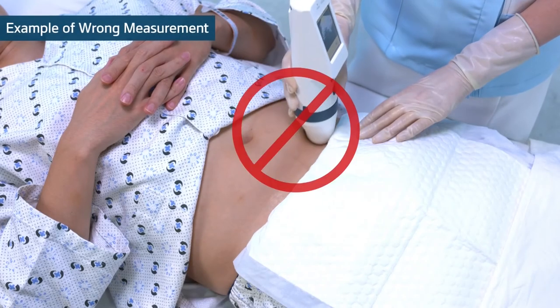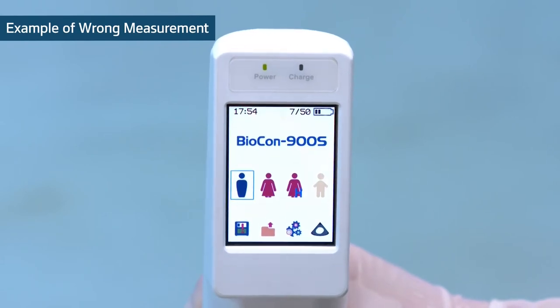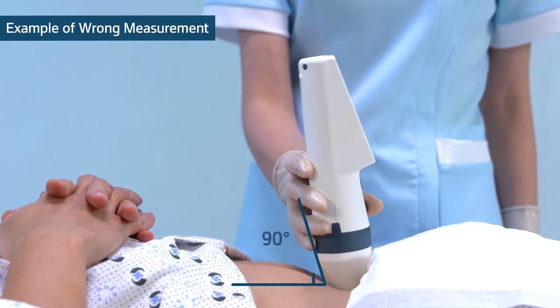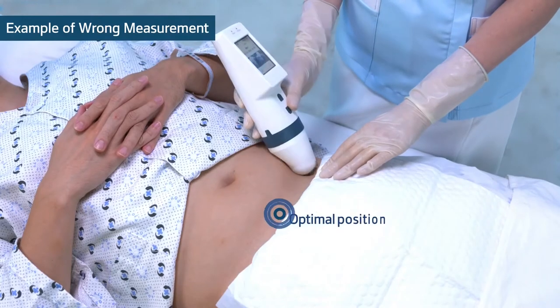Do not move the probe side to side. Do not lift the probe until the scan is completed. Do not tilt the probe over 90 degrees. Place the probe in the optimal position.